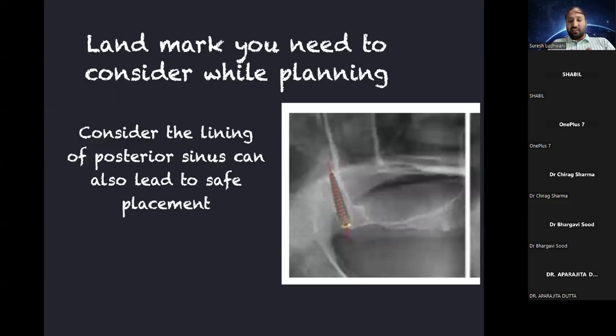The third, this is something which I've already discussed, that sinus lining. Follow the trajectory of the sinus lining. If you follow, you can safely place your implant. Again, as I told you, there are two aspects.